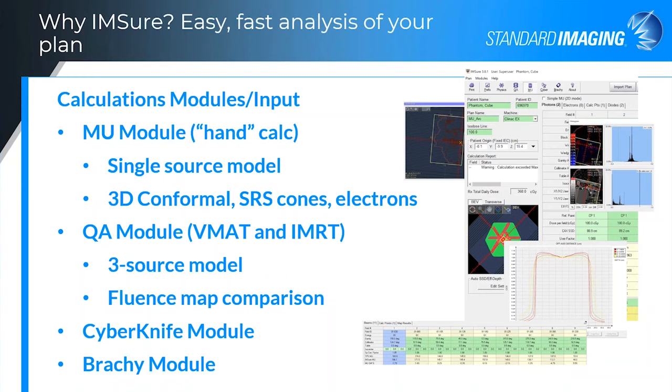So in today's webinar, I'll try to answer the question, why use IMSure? First, I'll give you a brief overview of each of the 4 calculation modules, as well as provide some details on the required input parameters as I step through each of the modules.